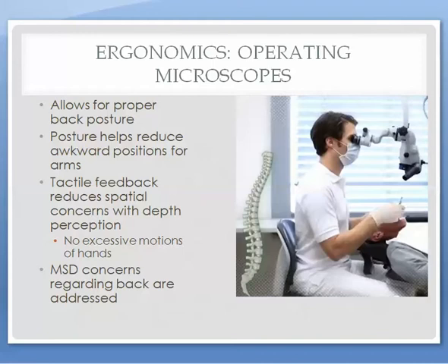A bigger advancement came in the form of the operating microscope. As demonstrated in the image, the spine is kept in the correct position and there's proper back posture. The awkward arm motion of resting the arm on the leg was reduced, as seen in the previous image, and concerns about depth perception are mediated by tactile feedback so that accuracy is not compromised. This instrument addresses one of the two primary areas of MSD complaints, notably the back.